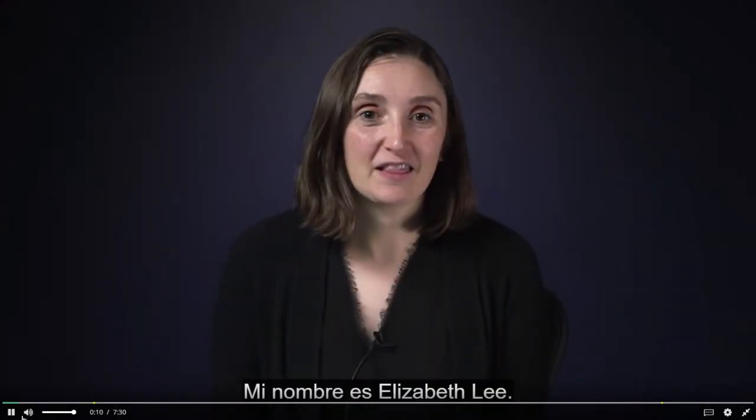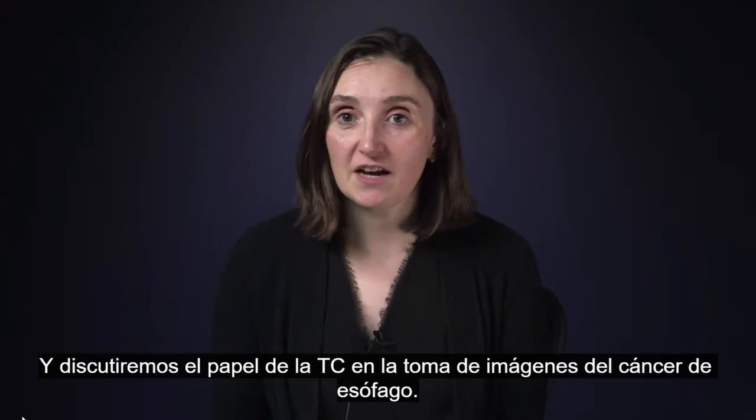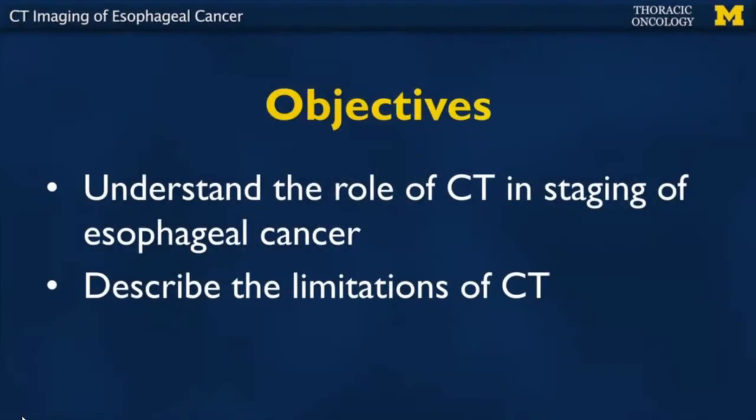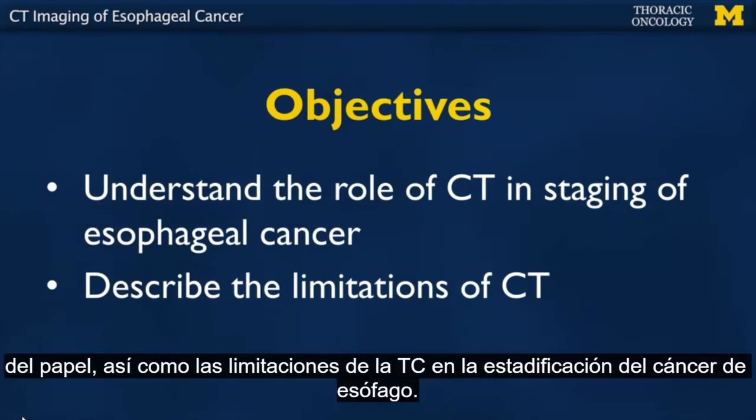I'm a fellow in the Department of Radiology at the University of Michigan, and we'll be discussing the role of CT in imaging of esophageal cancer. Objectives for this presentation include developing an understanding for the role as well as limitations of CT in staging of esophageal cancer.